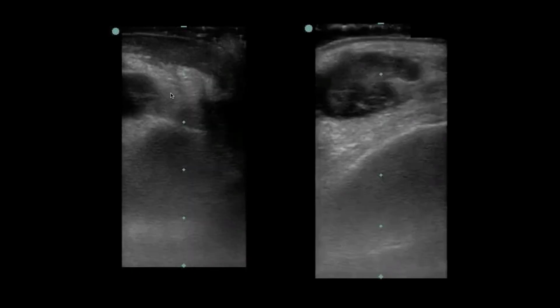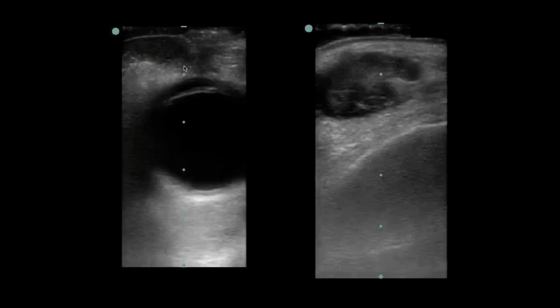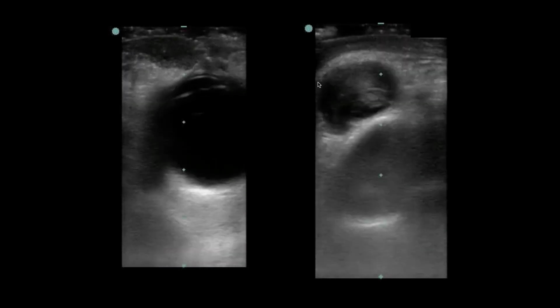This is a patient who was in an ATV accident and has a very large hematoma in this periorbital space. This is not a retrobulbar hematoma because it's anterior to the lateral canthus, but it is what a hematoma might look like if you were to see one in this posterior fatty area around the orbit. So something to look for if you are worried about somebody's vision after blunt trauma.